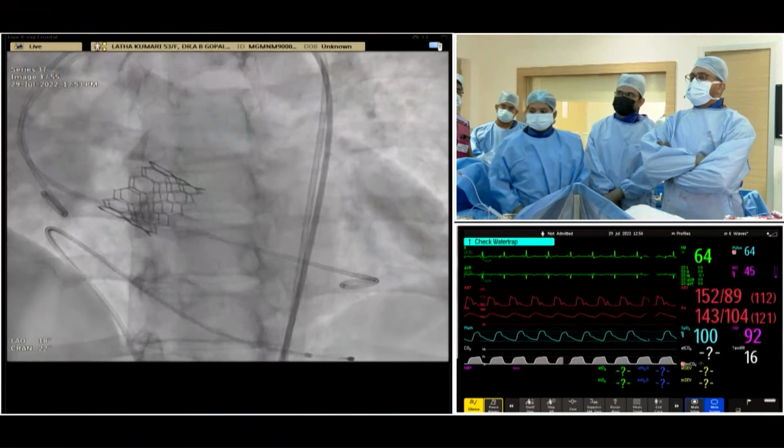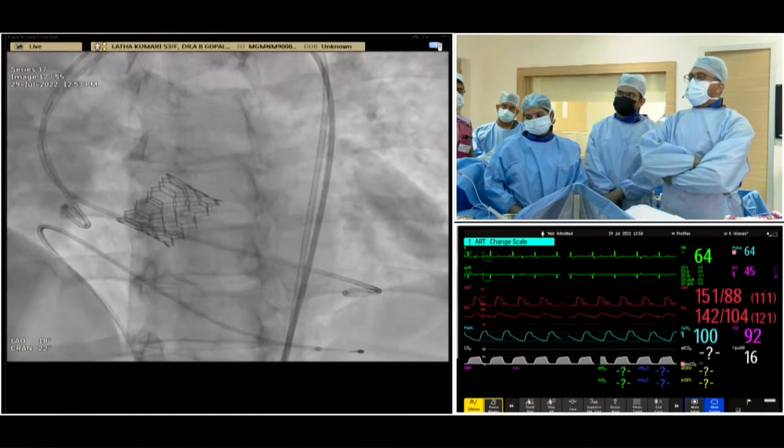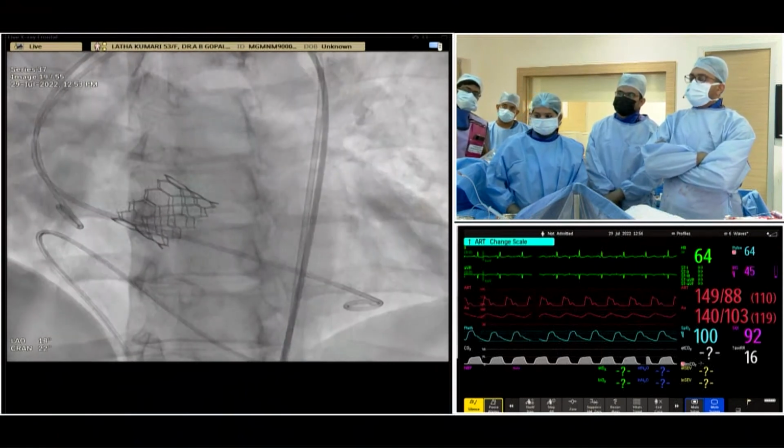In the US, suppose a patient of 53 years doesn't want surgery, would you advise TAVR? Yeah, I would certainly offer it to them if they said no way to surgery. So it's not a hard stop, but obviously this is a patient we would, just as you did, try to convince towards surgery as much as possible. I think that's a great positioning. The only thing that crosses my mind is that you have to balance the risk of a pacemaker, of course, but sometimes if the risk of pacer is not that high based on the membranous septal length, then I actually favor slightly lower implants, because I think it preserves the TAVR-in-TAVR options a little better downstream.